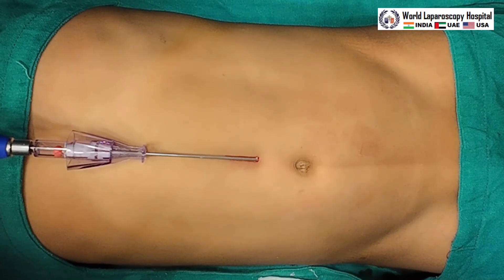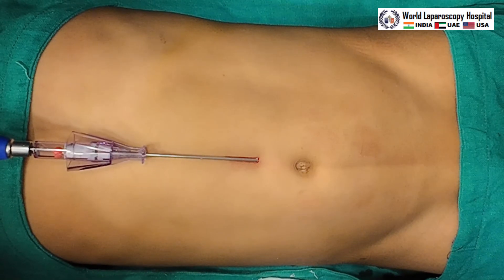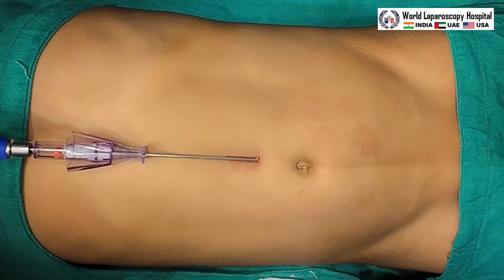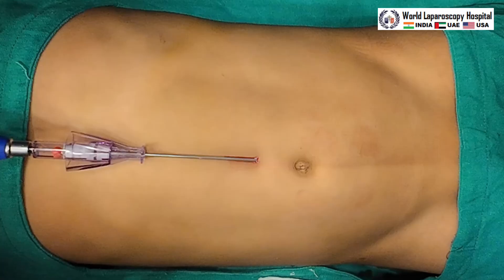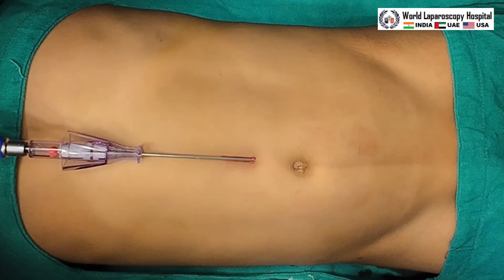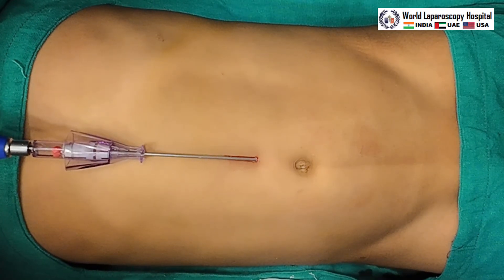Now we can see distension is complete. We will remove the Veress needle and put the optical port for the telescope. We are going to perform the surgery by 2 ipsilateral ports. Pneumoperitoneum is almost complete and actual pressure has reached the preset pressure of 8 millimeters of mercury.